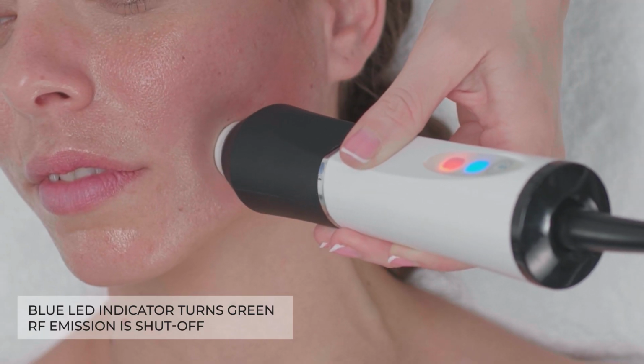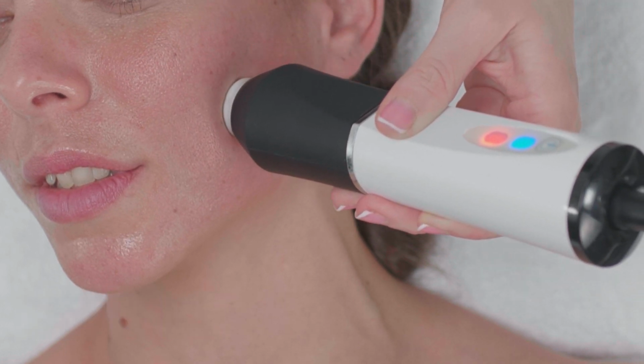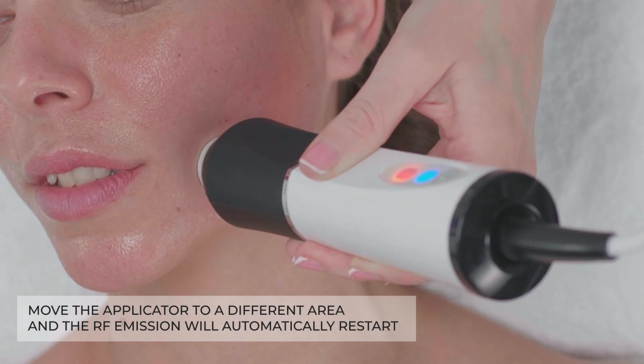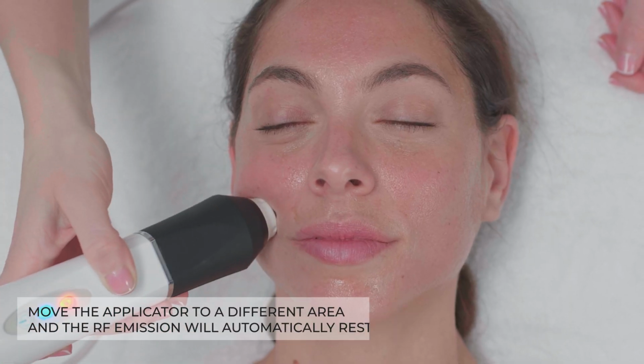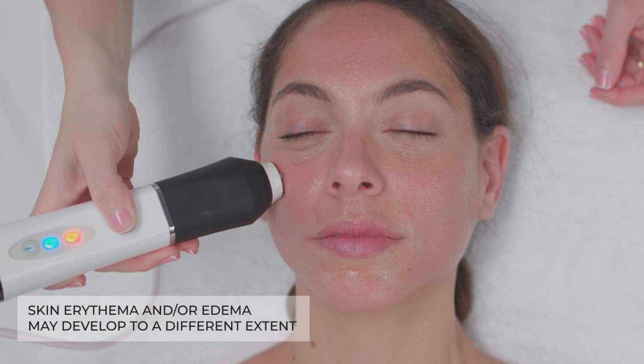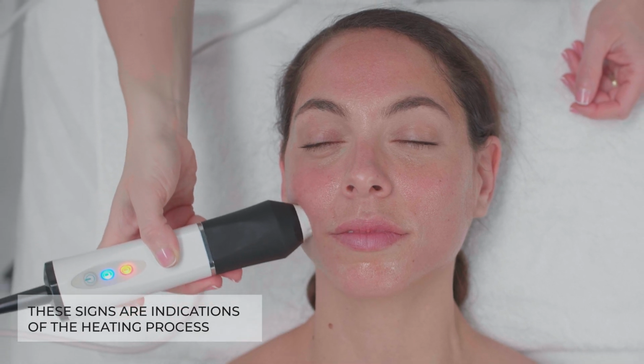An alert will sound and the blue LED indicator will turn green. In this case, expand the treatment area and the RF will automatically restart. During the treatment, some skin erythema or edema may develop to a different extent. These signs are indications of the heating process.